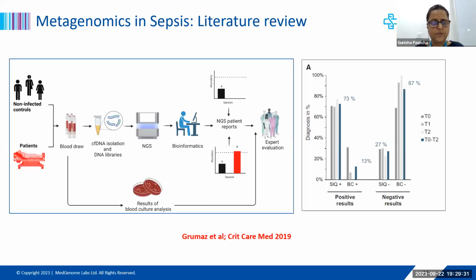So this is another study. There are studies where they have done total nucleic acid extraction. They've gone ahead with the DNA extraction, and then to cover the spectrum of all the microbes present, you can go with total nucleic acid, converting the RNA in that to cDNA, so that RNA viruses, DNA viruses, parasites, fungi, and bacteria could be included. There's another thought process which is actually gaining a lot of interest, and commercially available solutions are also available for sepsis, where the DNA extraction is a cell-free DNA extraction.